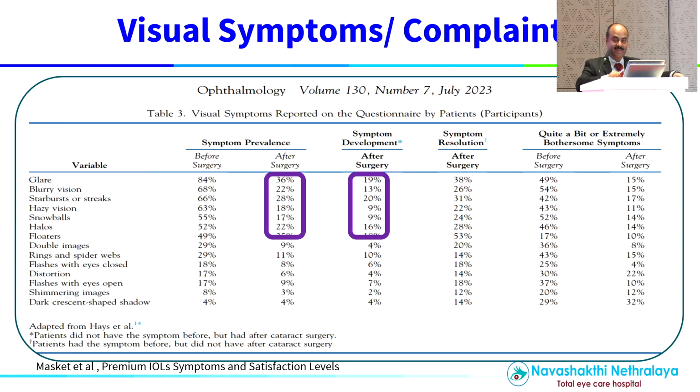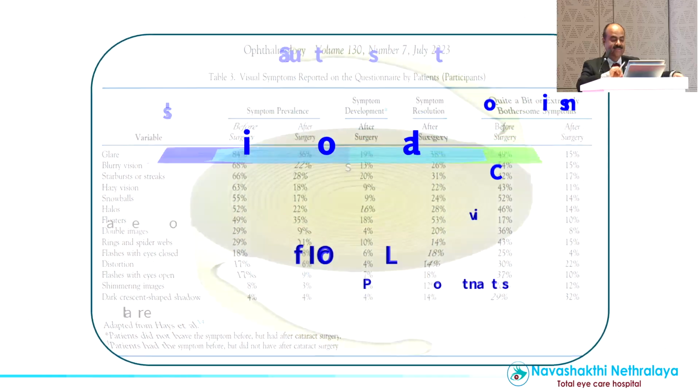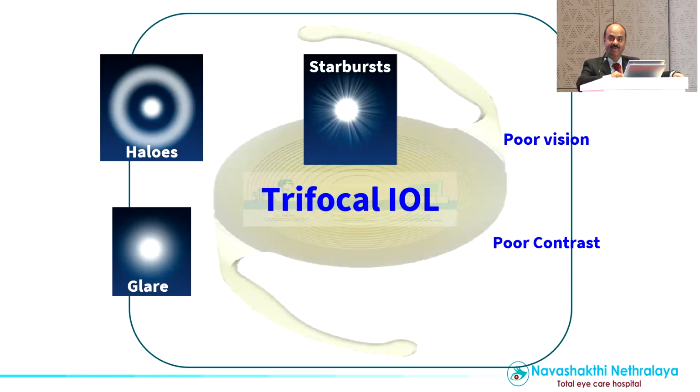Despite using the best of the lenses, this is what I've found: almost 35% of the patients develop either photopic symptoms or the need for glasses after surgery. And when we classify advanced IOLs, I've used the word trifocal, but it can apply to EDOF or anything. These are the commonest problems a patient reports: glare, halos, starburst, poor vision, poor contrast.